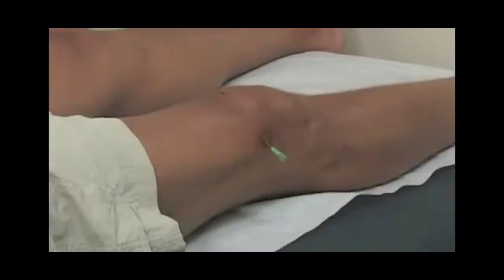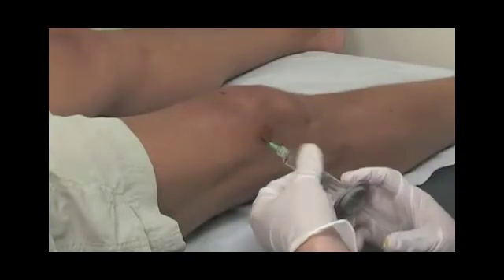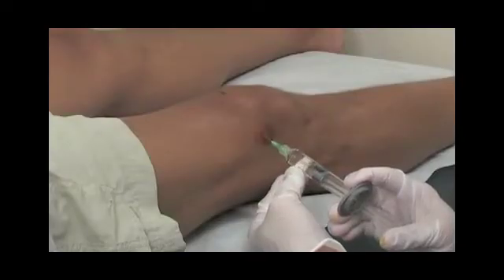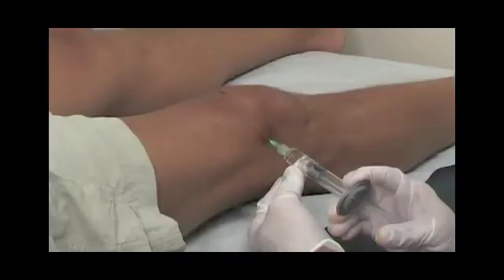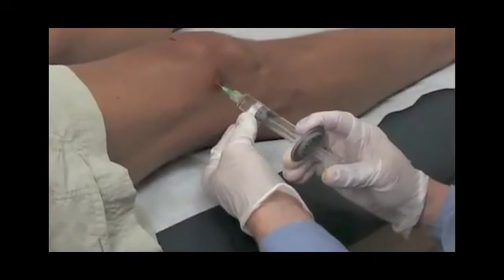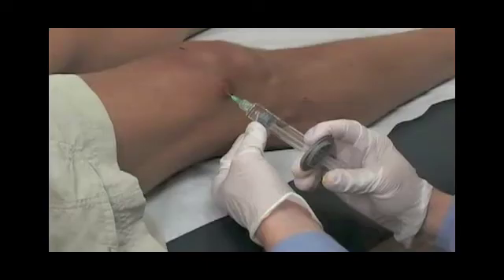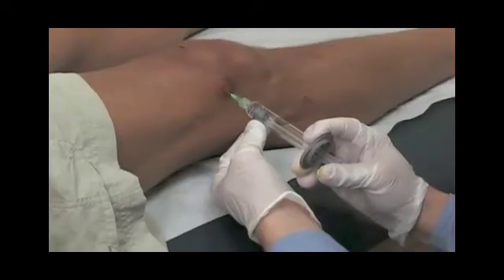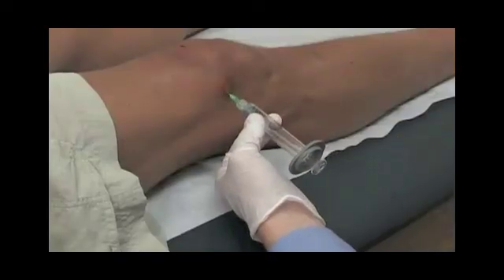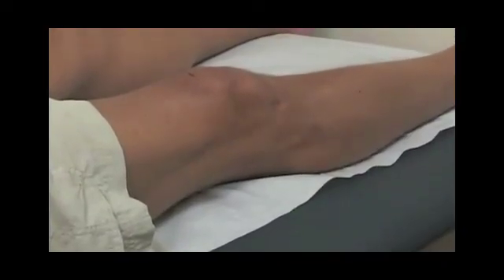We'll place the Synvisc-1 syringe on the needle and inject the Synvisc-1 into the knee joint slow and easy. While we place the injection, we're always ascertaining feedback from the patient on whether they're experiencing any pain or discomfort — they should not. Once the Synvisc-1 injection is fully placed into the knee joint, the needle is withdrawn and a bandage is placed over the injection site.